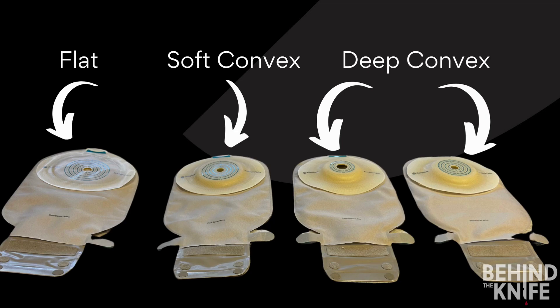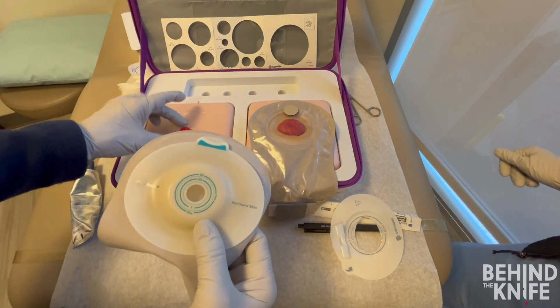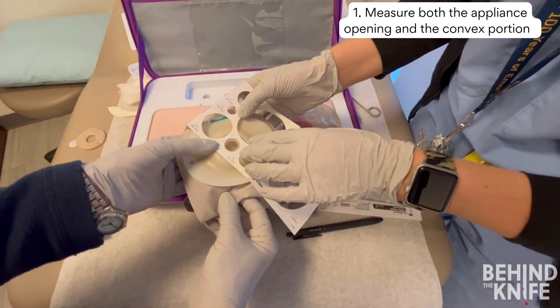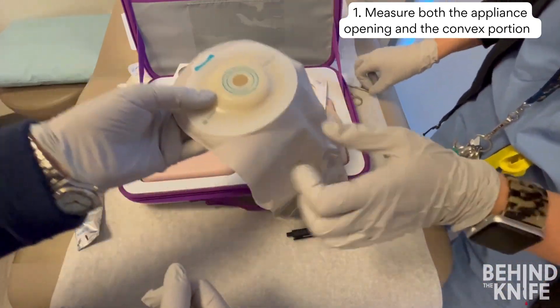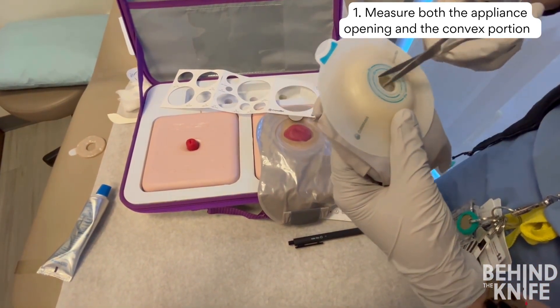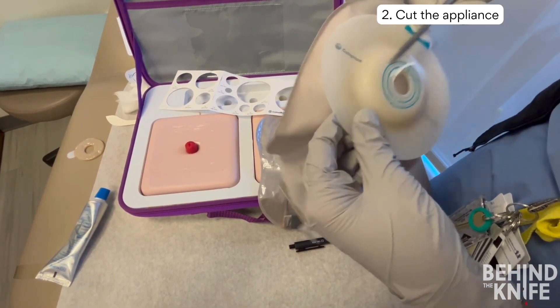Convex appliances come in two sizes: soft convex, which has a shorter lip and provides less pressure on the abdominal wall, and deep convex, which has a taller lip and can provide additional pressure. Applying a convex appliance is similar to a flat appliance, however measuring is even more important. You need to make sure that the opening on the appliance is large enough for your ostomy to move through freely, and that the circumference of the lip on the convex portion is large enough to apply pressure surrounding the stoma.